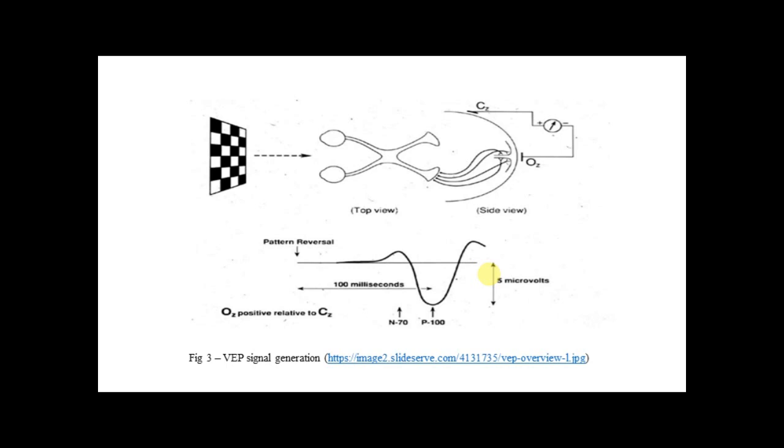By understanding this, we place our electrode right in between so that we get both signals. In this experiment, we try left eye alone and right eye alone also. So for that we have to place it in between to get both signals at the same time.